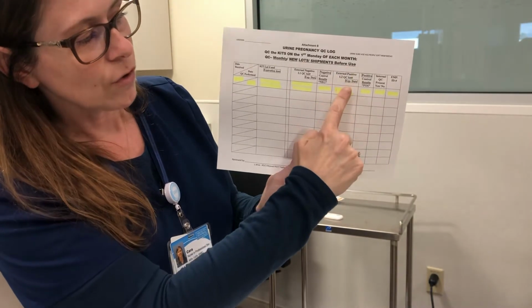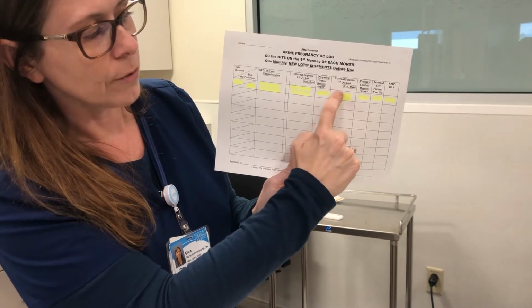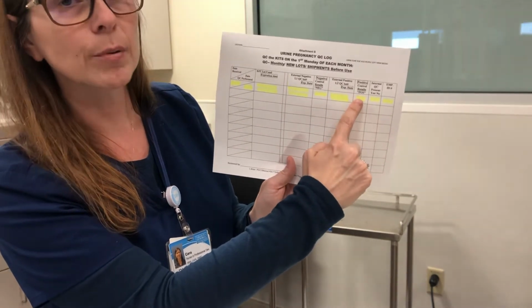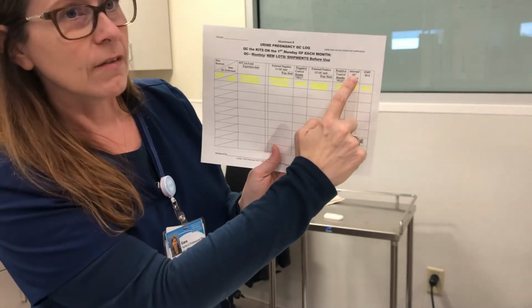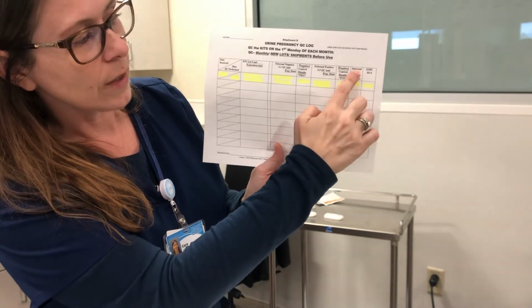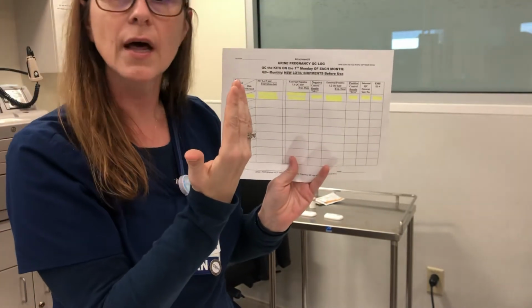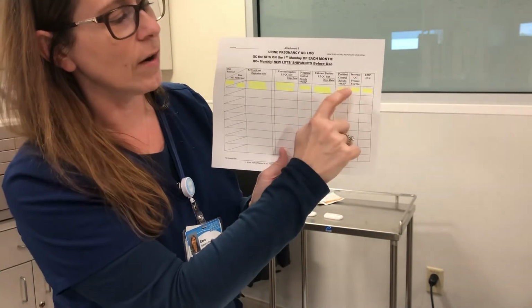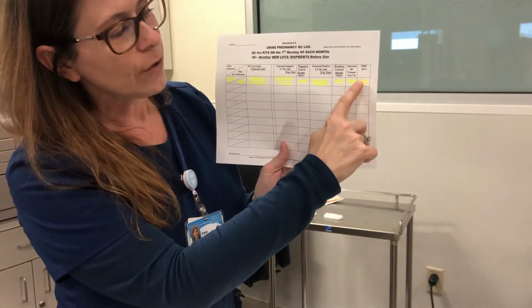Then your external positive, level 2 quality control, your lot number, your expiration, and this time it's POS, positive, not a plus sign, not the word positive, just POS. And then finally, you're going to write, yes, you saw the internal QC line, so that first pink line above the C on the cartridge, on that cassette. Was it there? If it's there, you passed controls, right? And then finally, your employee ID.